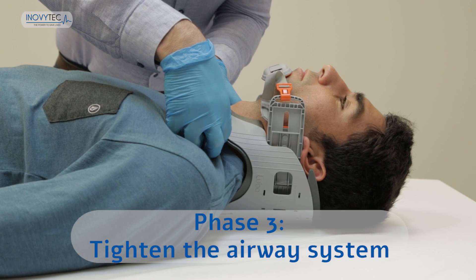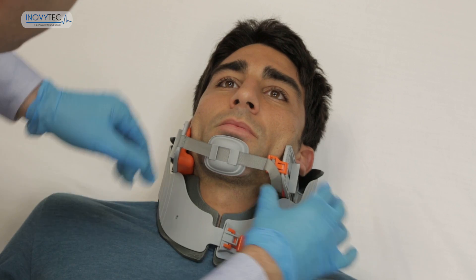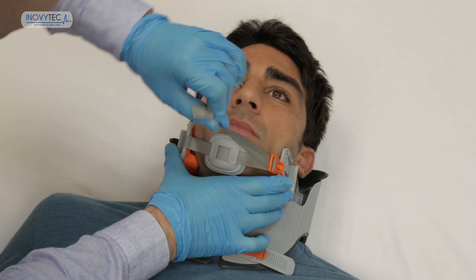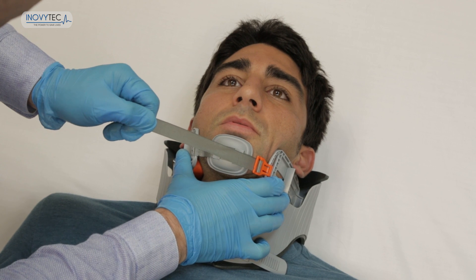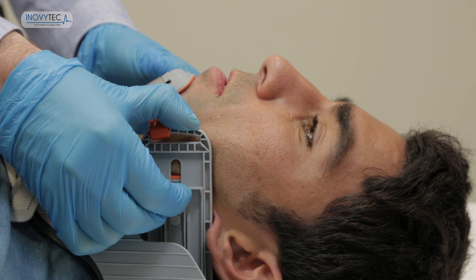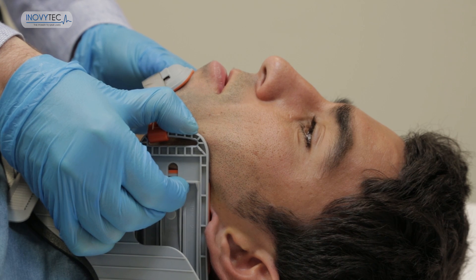Phase 3: Tighten the airway system. Readjust the airway system again by pulling the chin strap. Make sure the strap is fastened firmly, but not too tightly on the patient. Pull the mandibles to the forward position to open the airway. Phase 3 completed.